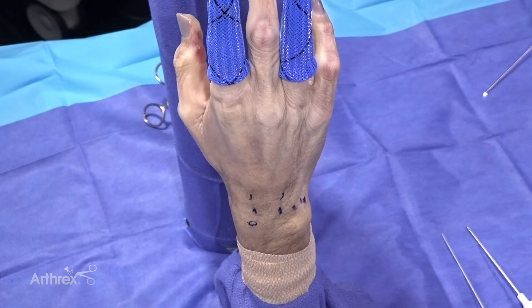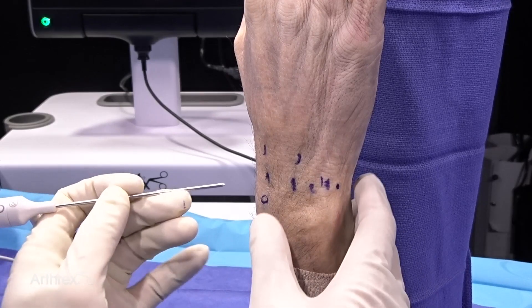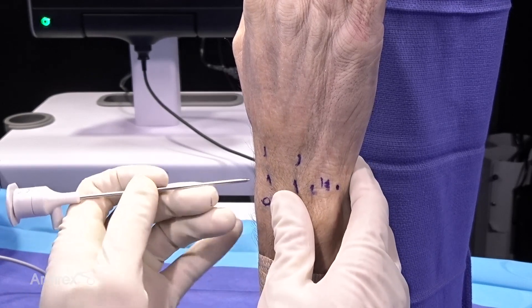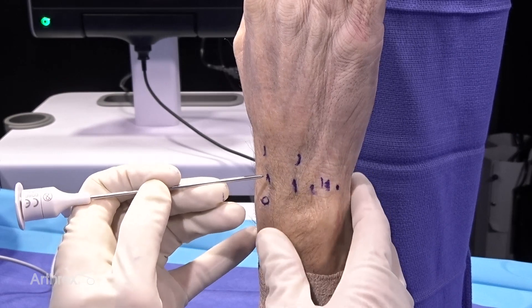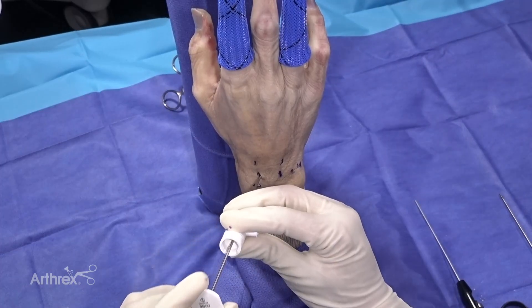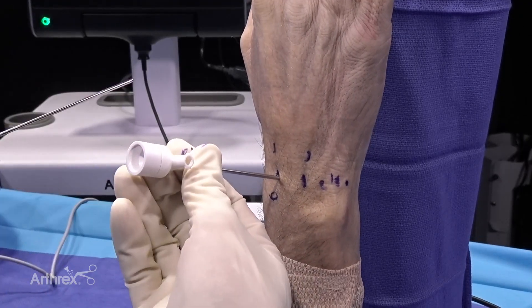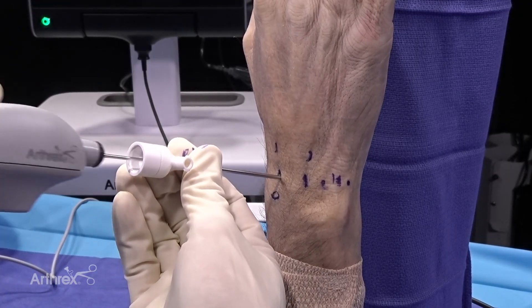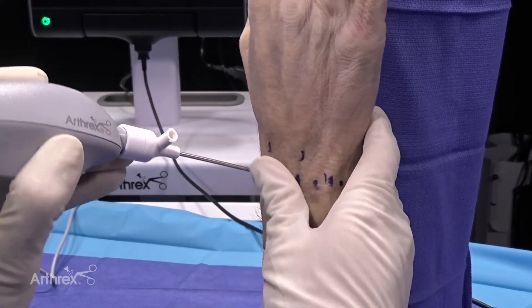In this wrist arthroscopy we're going to utilize the nanoscope. I've already outlined the wrist portals and we've already atraumatically punctured the capsule with standard instruments. We're going to insert the nanoscope with a blunt trocar — you can see the inflow cannula, small instrumentation, a huge advantage of the nanoscope. The inflow cannula has been introduced and we're pulling out the blunt trocar. We're going to introduce the two millimeter nanoscope. The insertion is easier than standard arthroscopy.